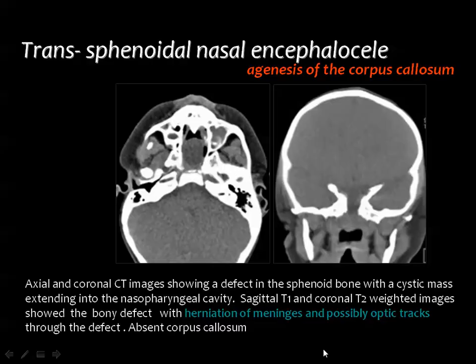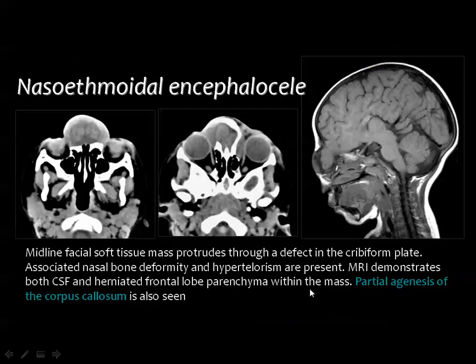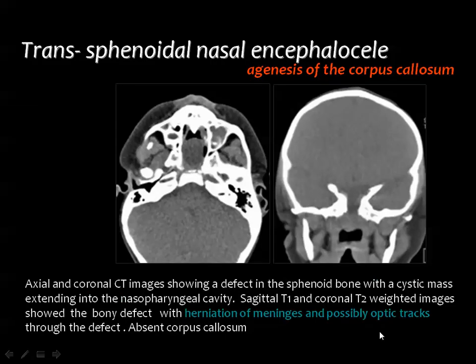A commonly associated anomaly is abnormality of the corpus callosum. In this case, only a very small part of the corpus callosum is visible; the rest of the corpus callosum is absent.